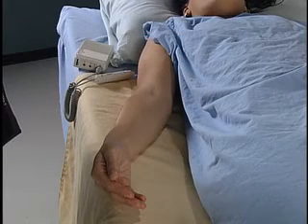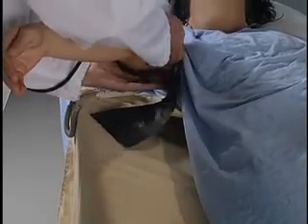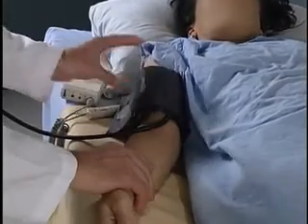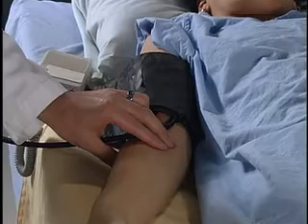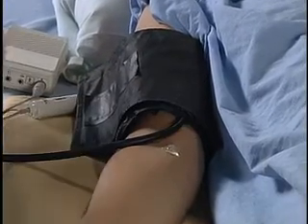To measure the Ankle-Brachial index, you will first need to measure the arm blood pressure with the Doppler probe. It is important to choose a sphygmomanometer cuff of the appropriate size. This is placed over the upper arm. Palpate the brachial pulse and apply gel with the probe at the site where the pulse is felt. Place the Doppler probe lightly on the gel at a 60-degree angle towards the patient's head.